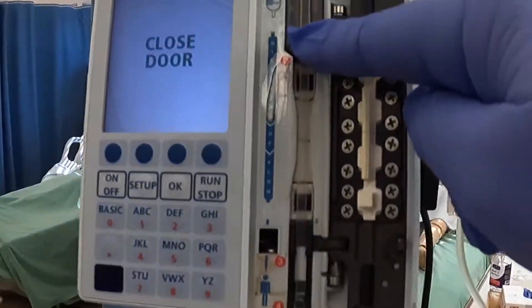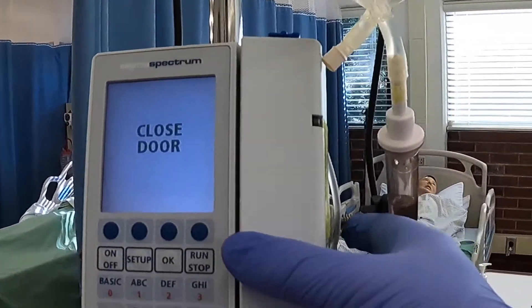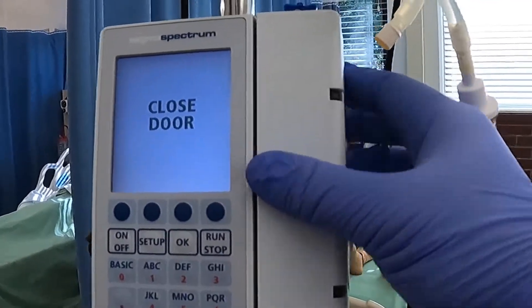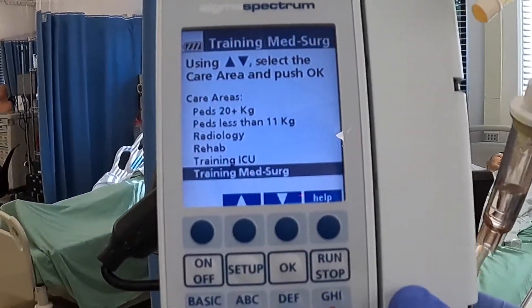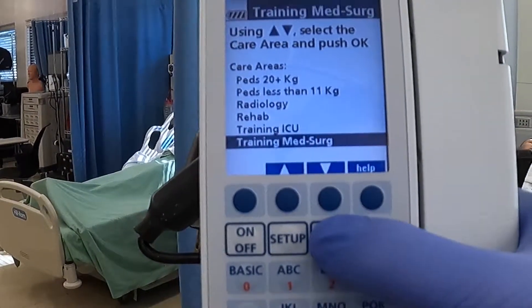As you can see, there's one up here, two, three, and then four. Once you have it correctly done, it's going to tell you to close the door. From there, you're going to be looking at your screen, and we're going to click training med-surge — it's already on that one — so we're going to hit the okay button.